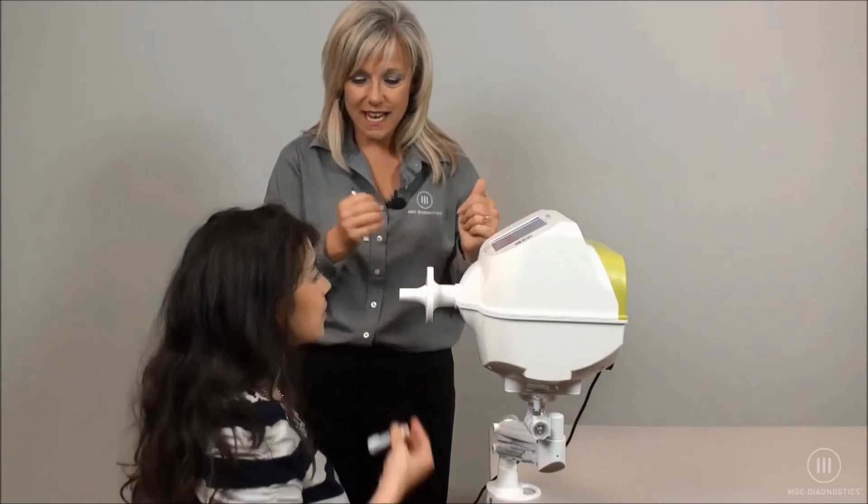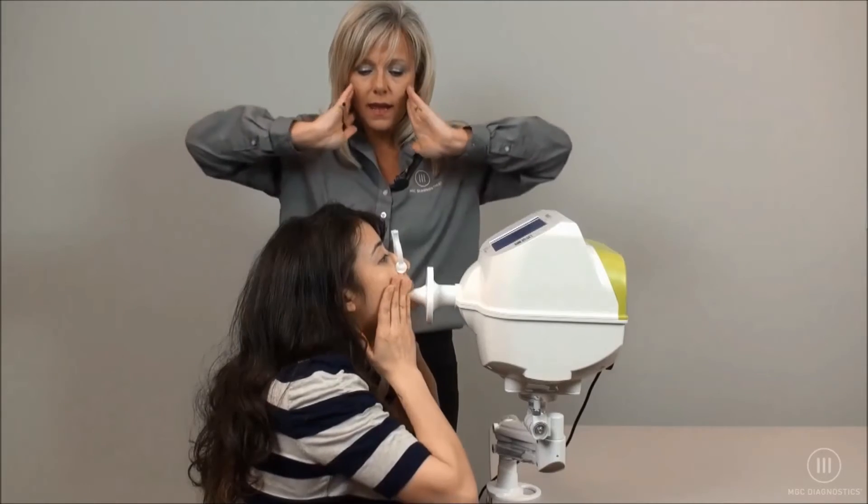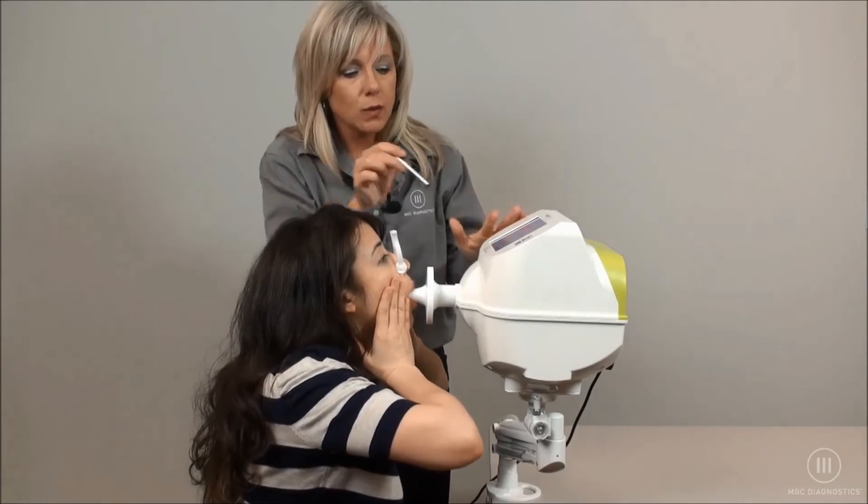Are you ready? Wonderful. Attach to the mouthpiece please. Tight seal, nose clips on, hands on cheeks, elbows out. And we're ready to begin.